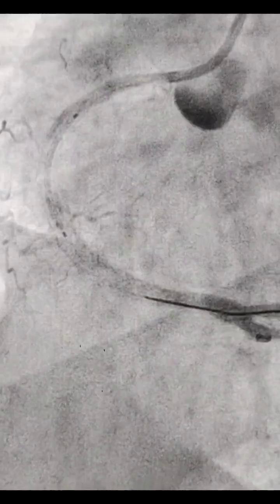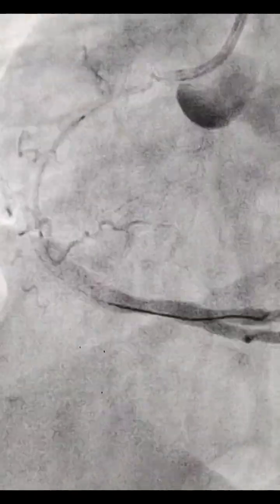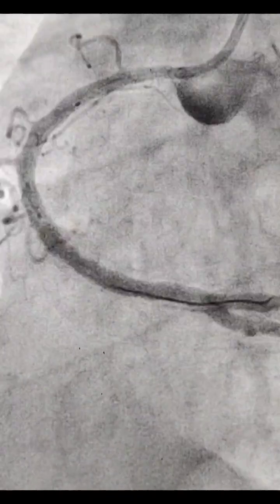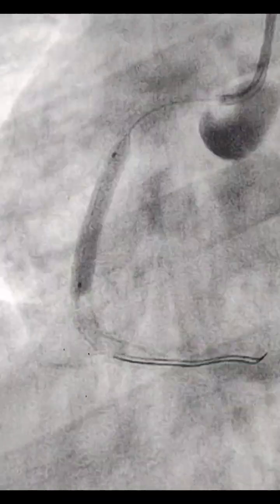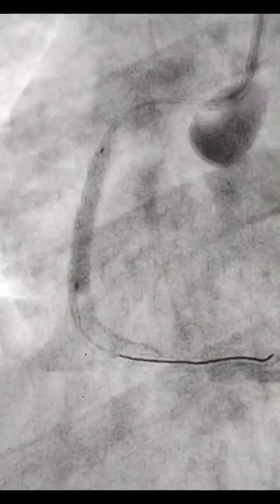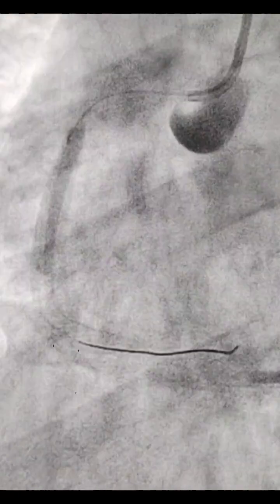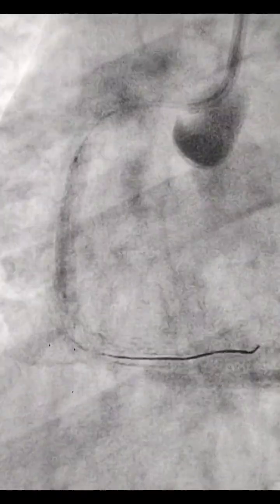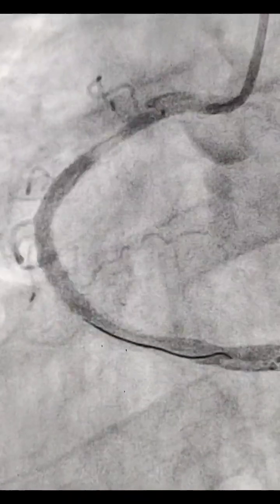Now just notice the contrast is not getting cleared in the aortic cusp, and you can see how the contrast is getting retained. So we deployed the stent, and it came to my notice that contrast is not getting cleared from the aortic root. I just deployed the stent, and now this is the picture. So now what to do?